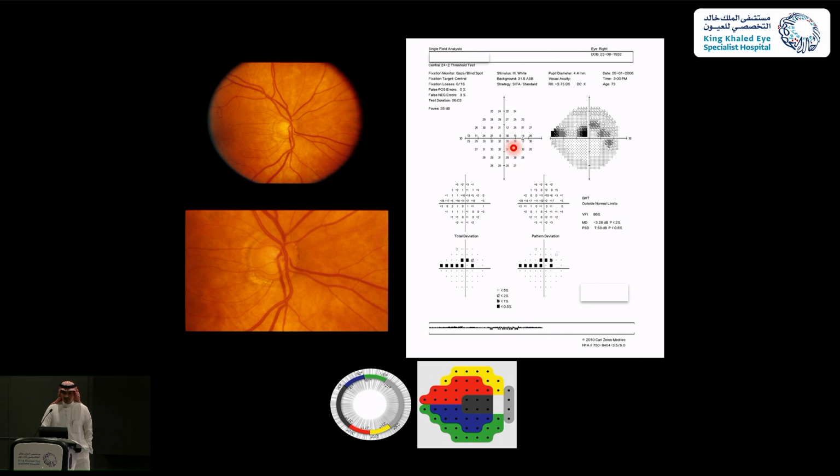You will go for the defect. So the patient has a superior scotoma. If you want to call it arcuate, it's fine. After that, you will evaluate for compatible disease. You will look for the optic nerve head damage here. And the patient has focal optic nerve head damage affecting the inferior pole, corresponding to the reddish zone, and you expect the patient to have these changes in the visual field, which actually match the reality.